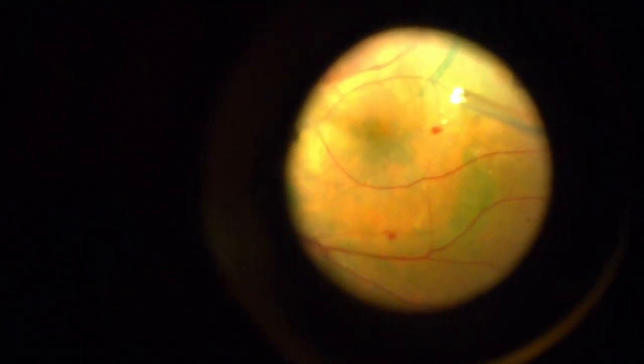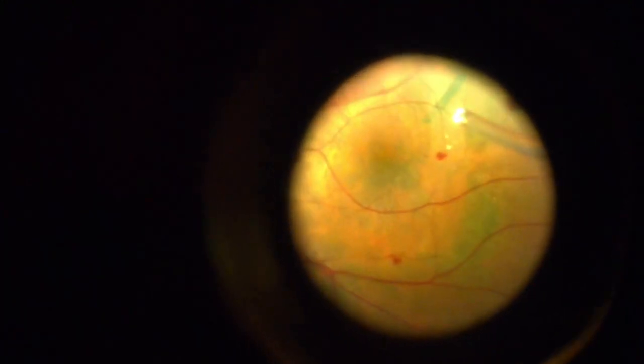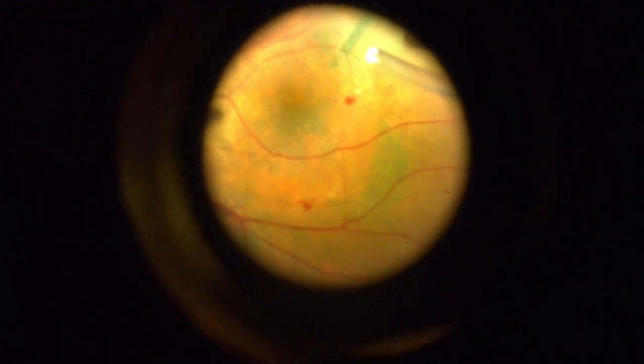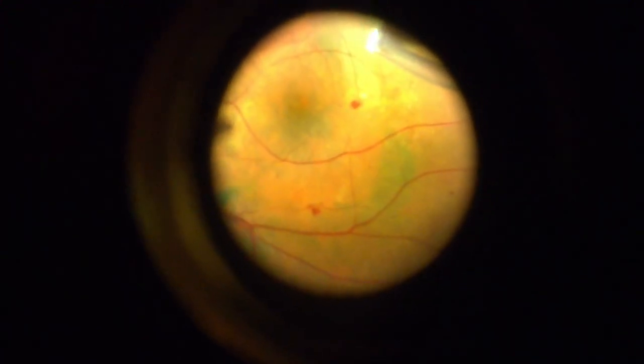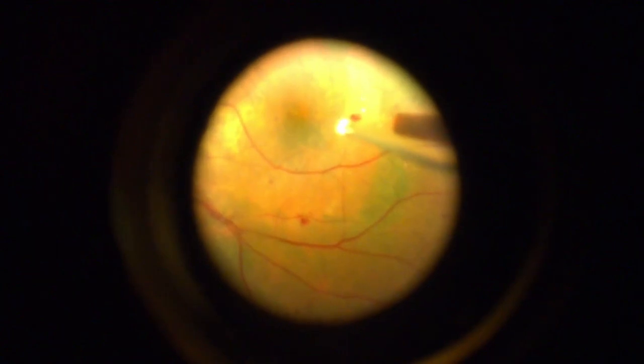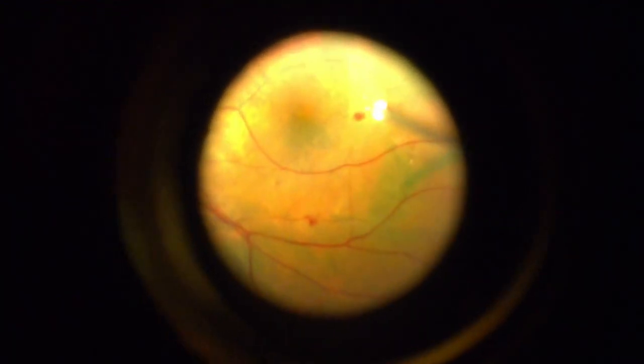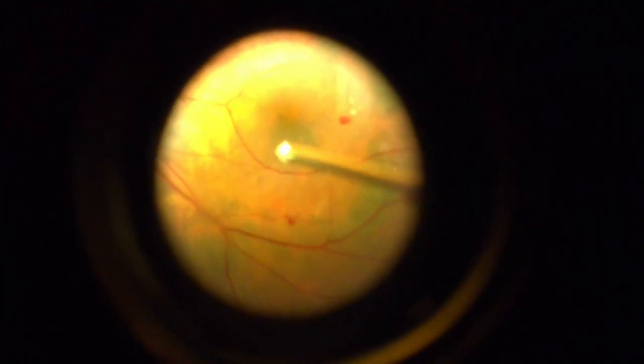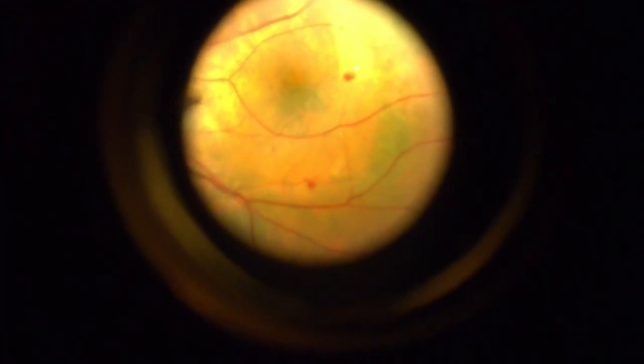And sometimes it can be really handy because the vitrector has a broader bite spot than the forceps. So if the membrane's shredding a lot, I'll just take this piece out first. You see the other ones flying around. I'll tell you what we can do is stain again first to make sure everyone can see what's going to happen here. So a lot of times I'll restain.